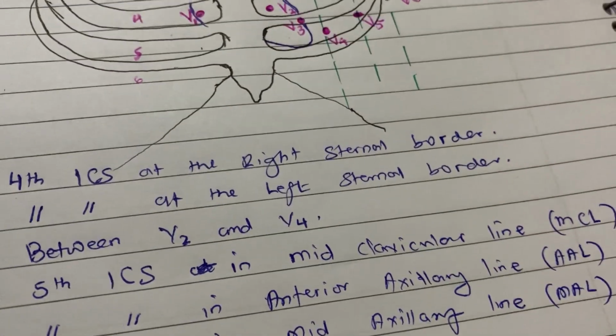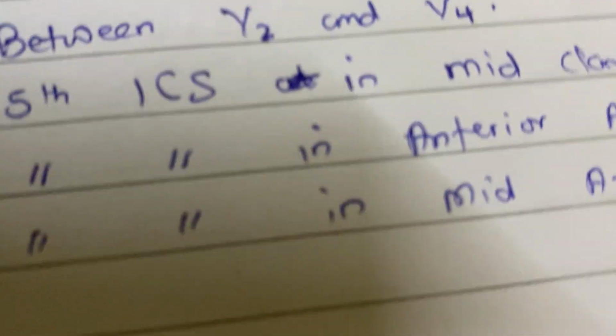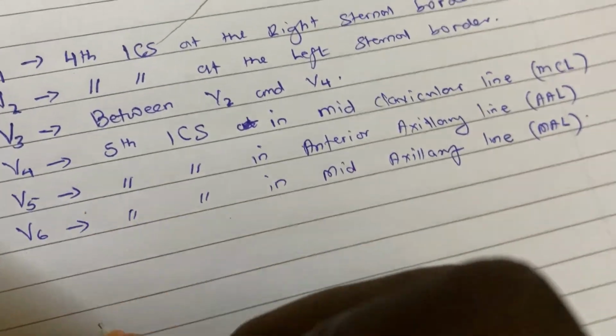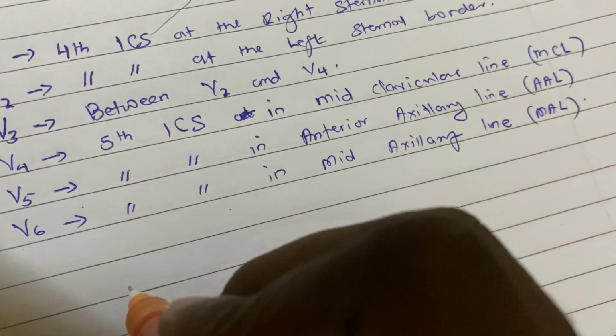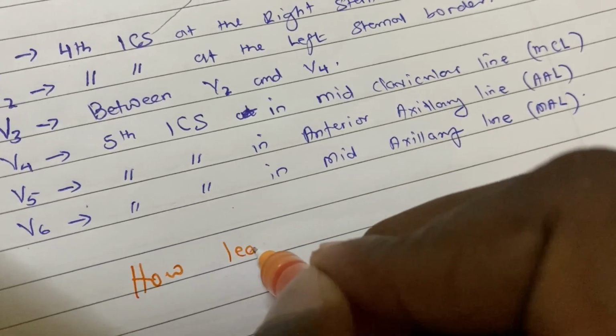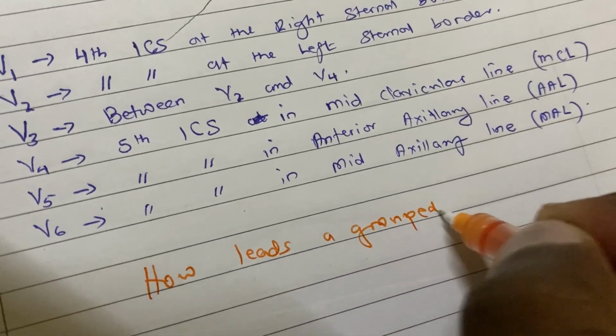Yes, we are going for something new, but before that, let's recap what we need to know: how leads are grouped. This is grouping.